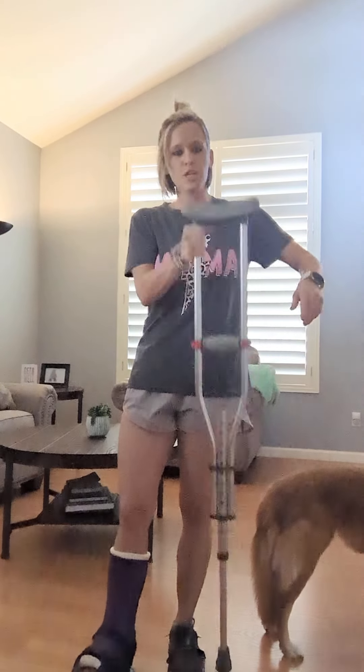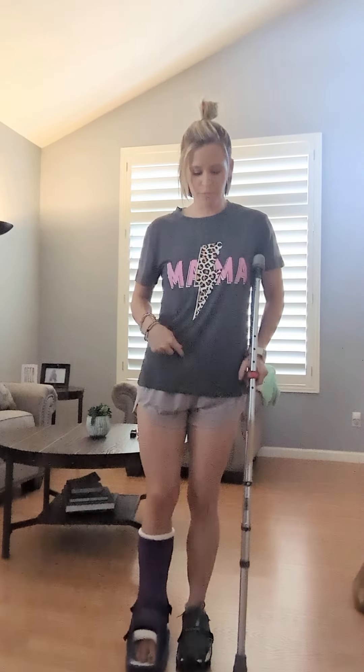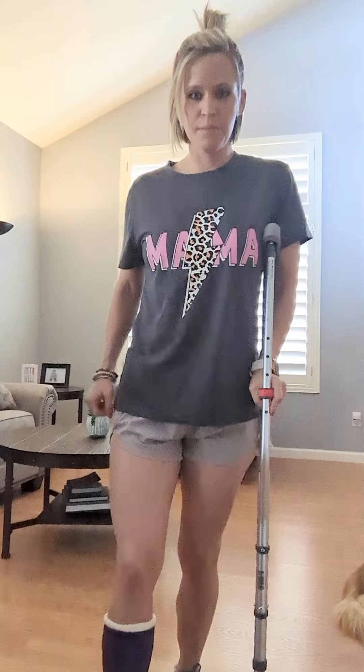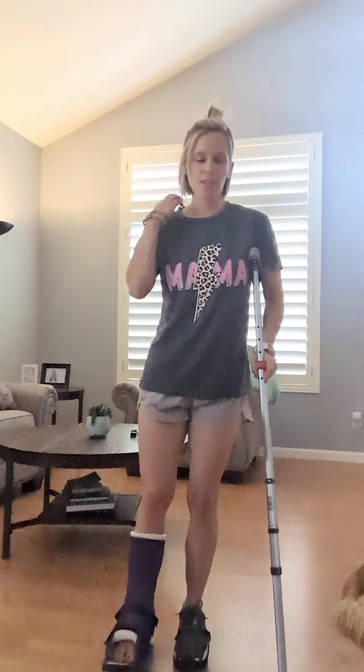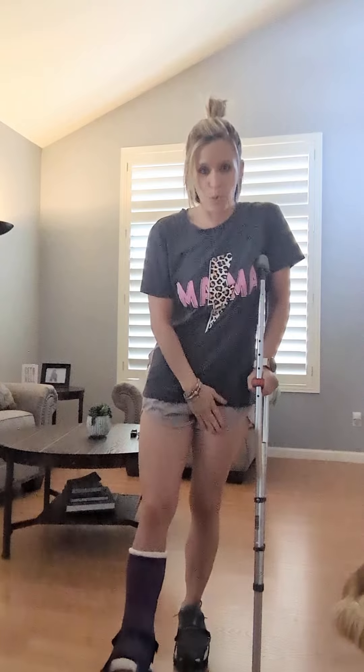So the crutch is on this side. It's going to move with me — as I go to take that step forward, I'm going to move the crutch along with me and then progress that other foot. I am not yet cleared for full weight bearing. As I do this, I'm shifting my body weight over here, I still have more weight in this foot, and then I'm stepping through.